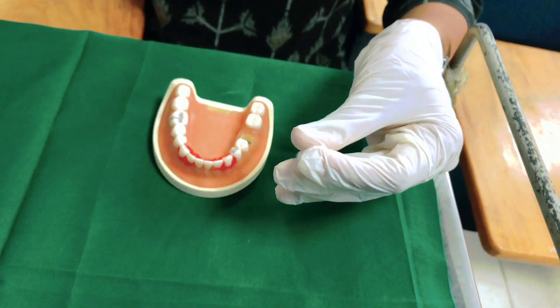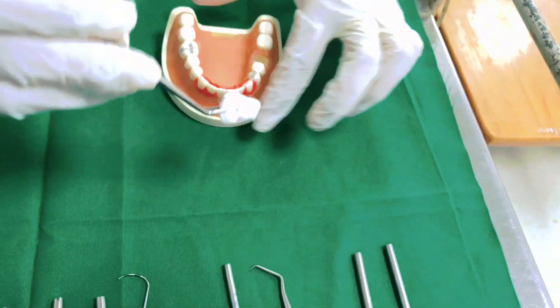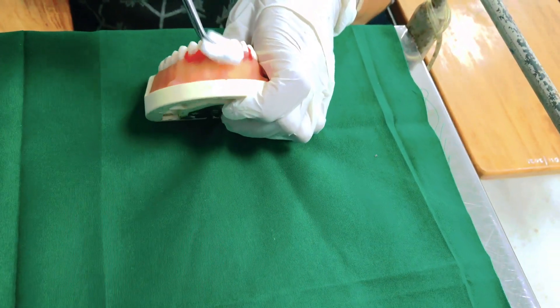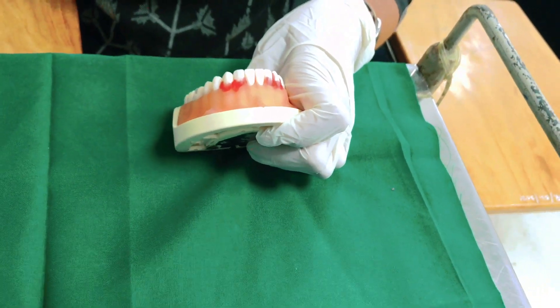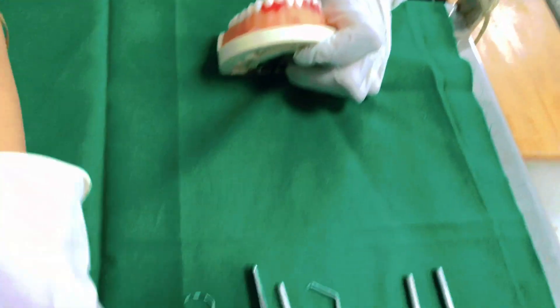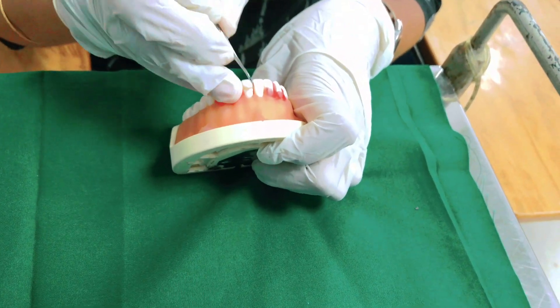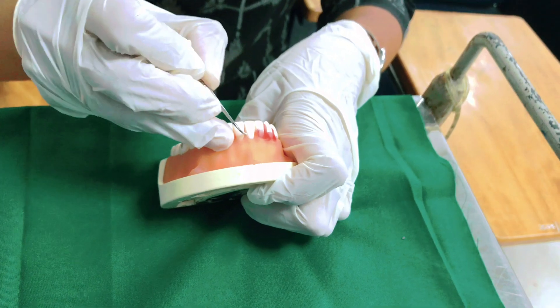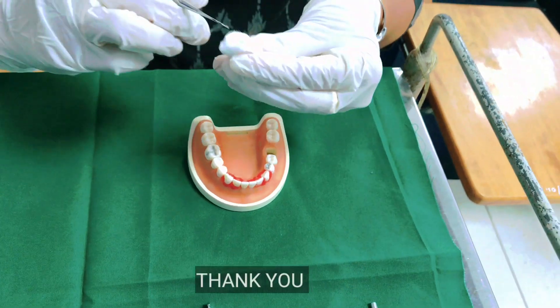Remove your scaler — there is still some more calculus interdentally, and that can also be removed. You can also use your sickle to remove it completely. Is it clear? Fine, thank you.